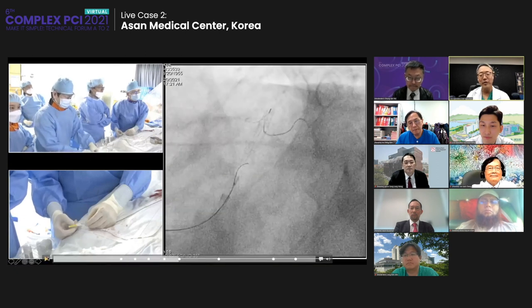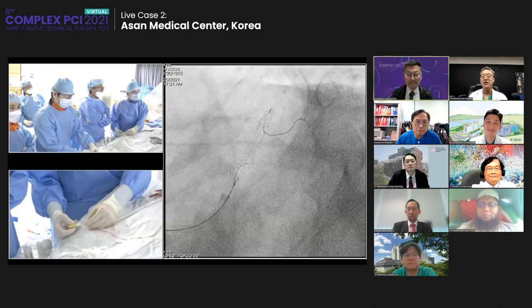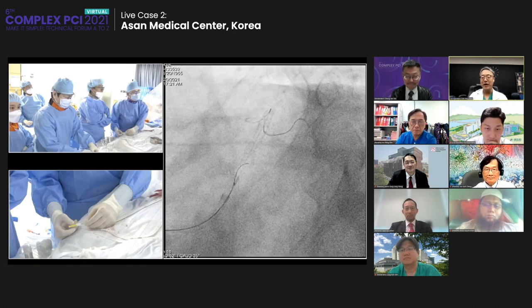Okay, we will have some discussion time, and we already spent nearly 30 minutes, at least 30 minutes. We changed several wires: the BMW wire, the Choice PT wire, and this is the Gaia second, a CTO wire. Although we tried several times and changed hands, I tried several times and Doyun tried several times, but it does not pass well. So SJ recommended some modification of neointimal hyperplasia using a high pressure non-compliant balloon 4.0. What do you think about that? Would that work? I would like to ask a moderator or panel, do you have any experience with that?